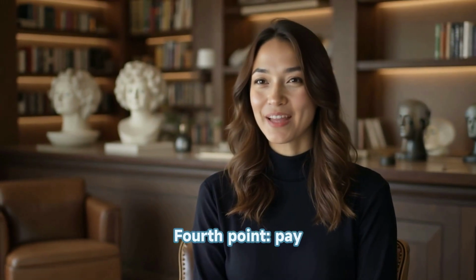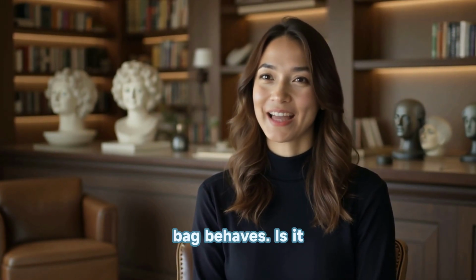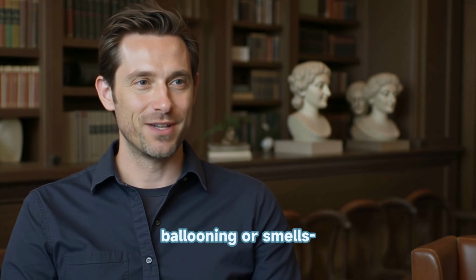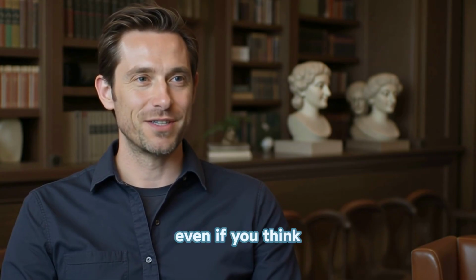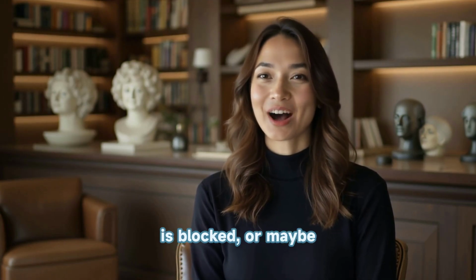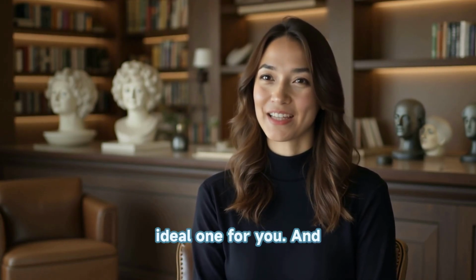Exactly. Fourth point. Pay attention to how the bag behaves. Is it staying relatively flat? Are odors controlled? If you're having ongoing issues with ballooning or smells, even if you think you're using the sticker correctly, then it's a signal. It might mean the filter is blocked, or maybe this bag just isn't the ideal one for you. And that's okay.